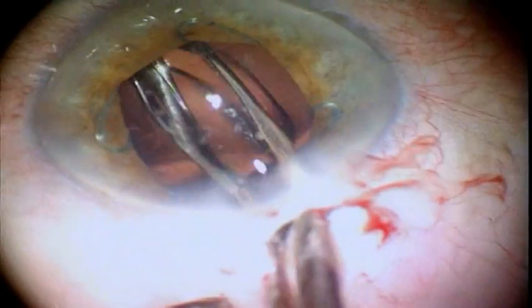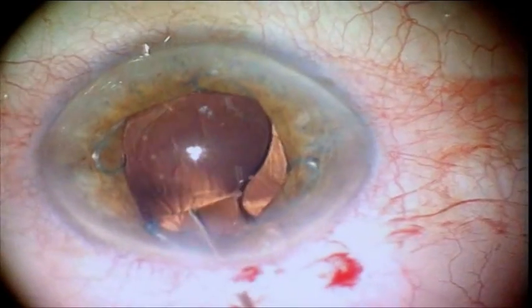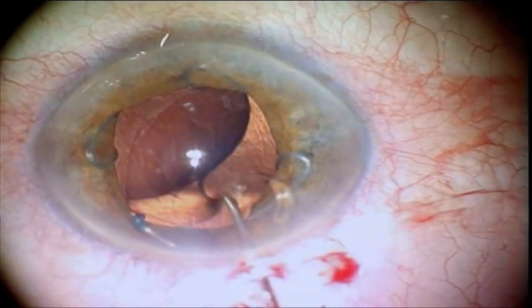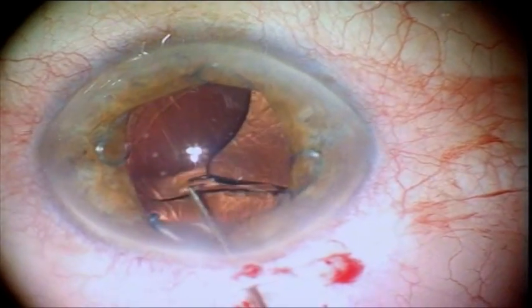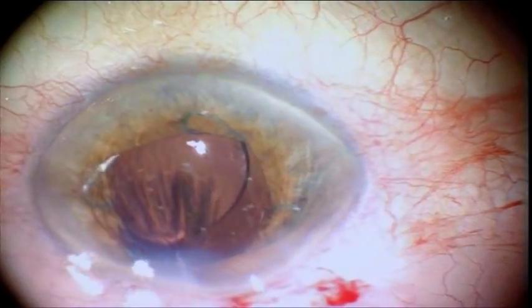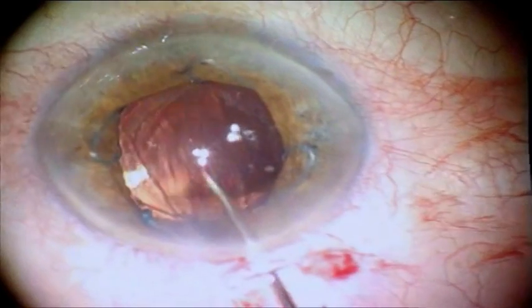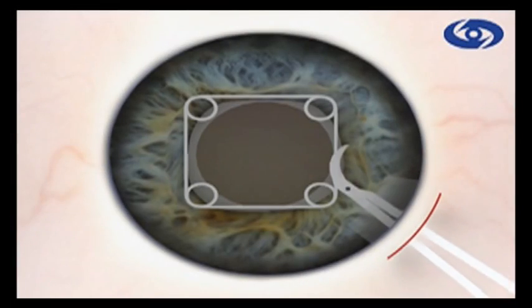For IOL implantation, either injector or forceps technique is possible. The lens is easily passed through the pupil into the posterior chamber and then into the capsular bag. Positioning of the trailing haptics is also straightforward.